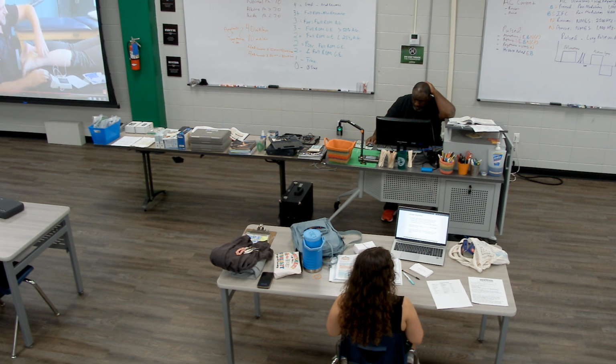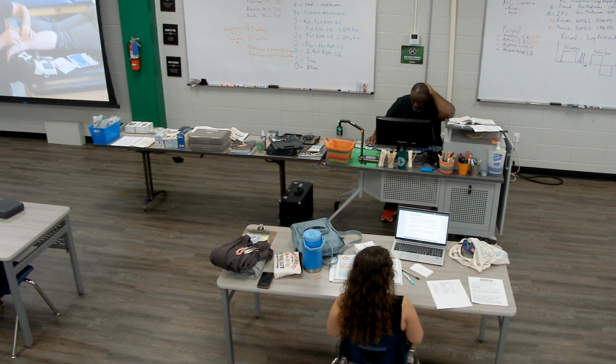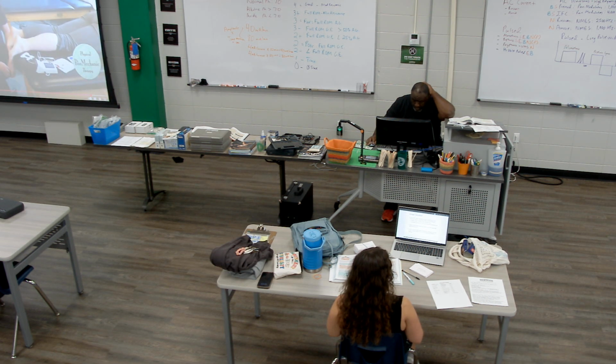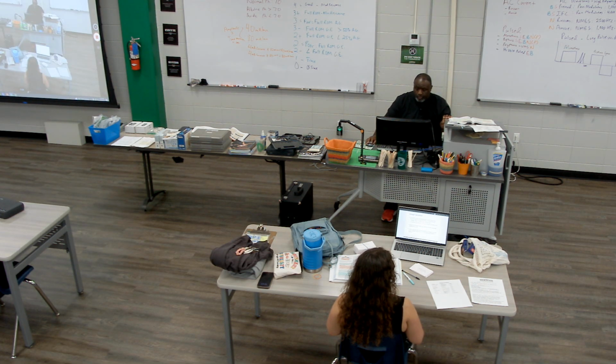The other one that we use is the to-go patch. So the same thing applies. The negative side goes to the focal point, positive side away, and the patient will leave with it on. Okay, so that gives some clarity, just kind of showing you how it's set up.